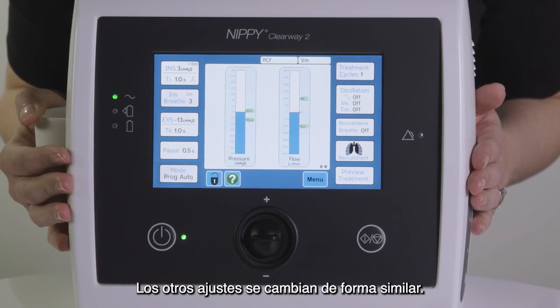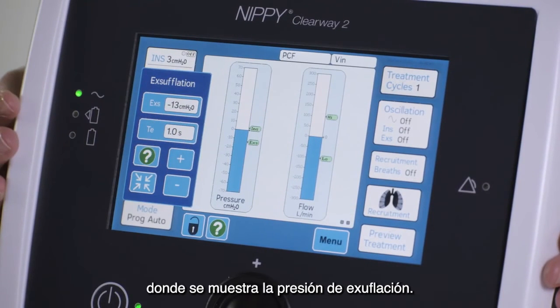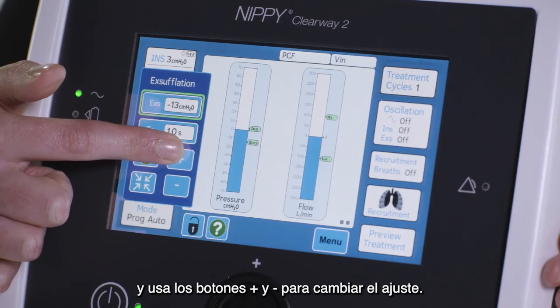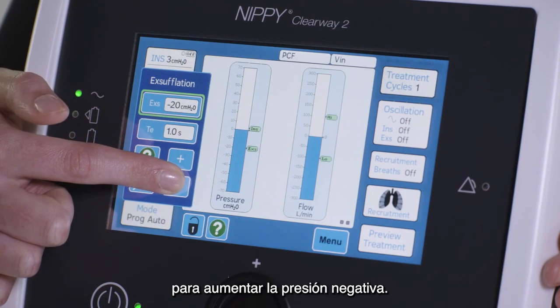The other settings are changed in a similar way. For example, to change the ex-sufflation, or negative pressure, press the button in the middle on the left side of the screen where the ex-sufflation pressure is displayed. When the window opens, select the ex-sufflation pressure setting and use the plus and minus buttons to change the setting. Don't forget, when changing the ex-sufflation pressure, you must press the minus button to increase the negative pressure.